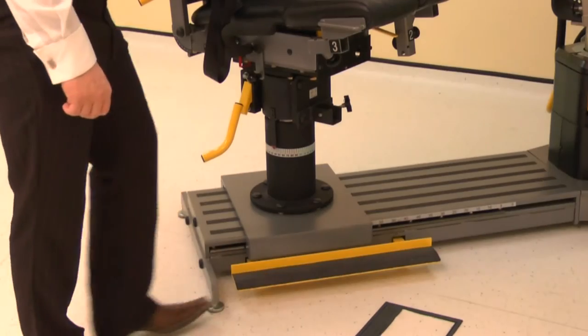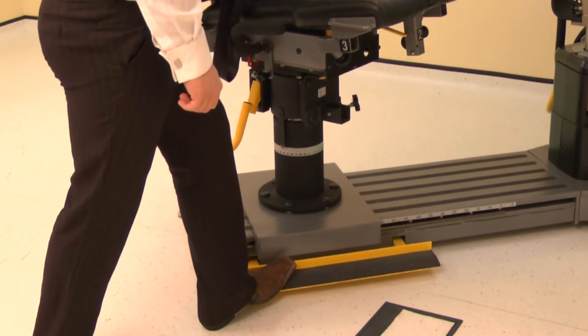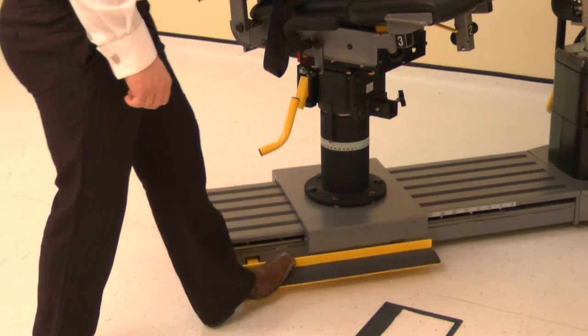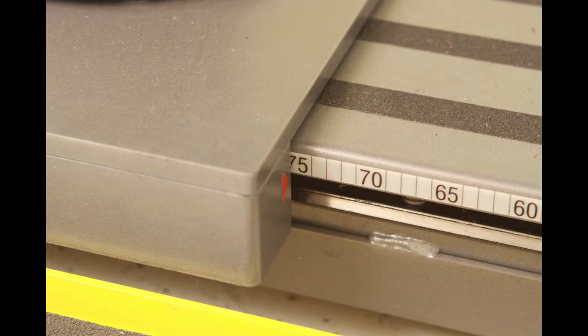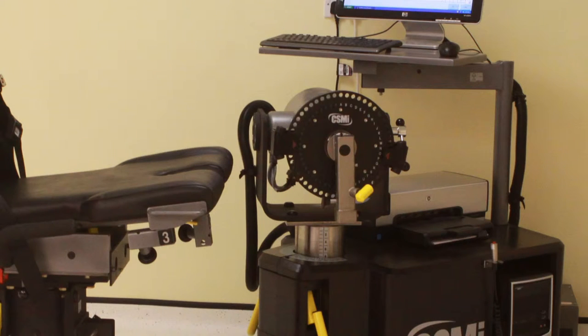Finally position the monorail by pressing the kickboard and sliding the chair to position 75. The dynamometer is normally positioned so the subject stands on the base plate. However, it can be rotated for taller subjects so they stand on the floor.